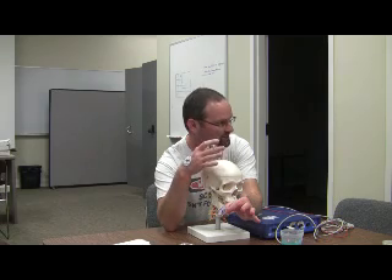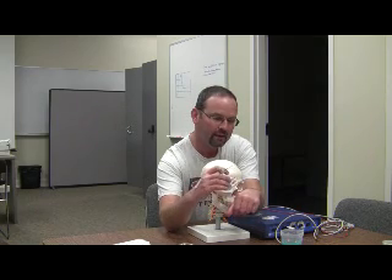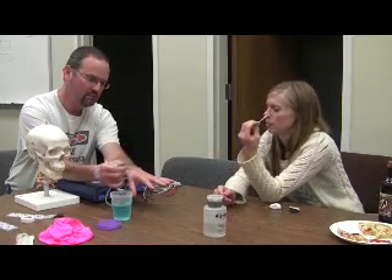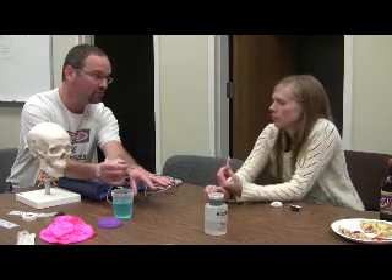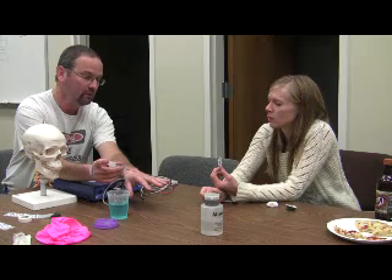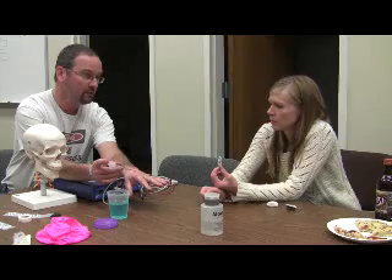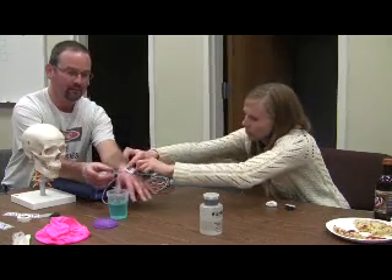Using a system I'll teach you in a minute, you find the right spot on the head — you don't just eyeball it, there are procedures to get reliable placement from subject to subject. Find your spot, make a mark or put your finger there, and abrade it: go back and forth maybe 20 seconds, then counterclockwise about 20 seconds, then clockwise about 20 seconds. Now holding the needle in place — because it's pointing to the spot — your partner places the electrode right over it; the black disc should go right over the tip of the needle.